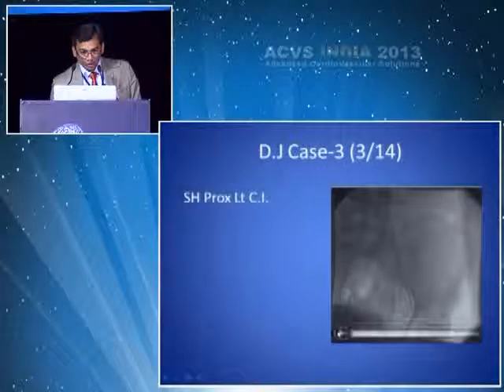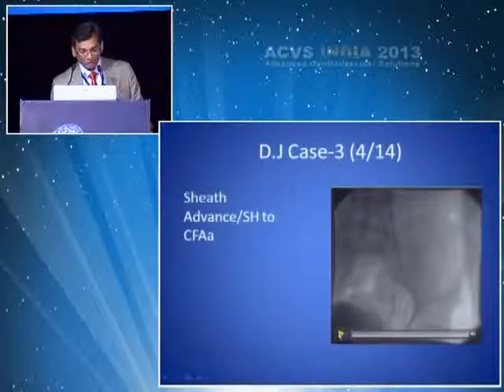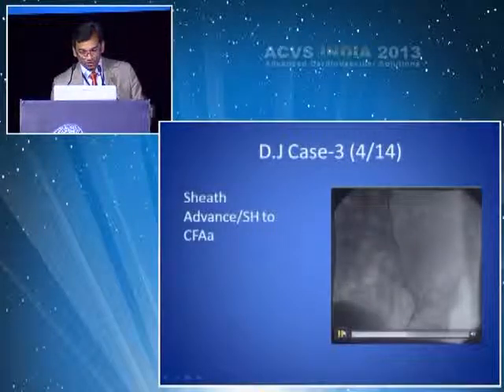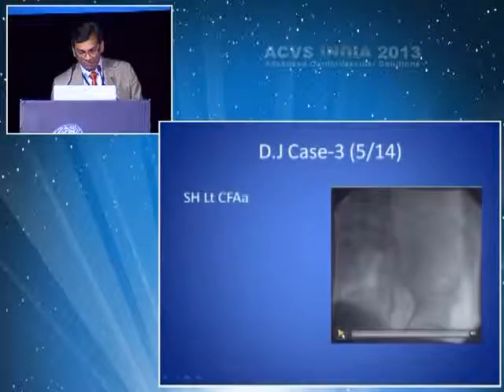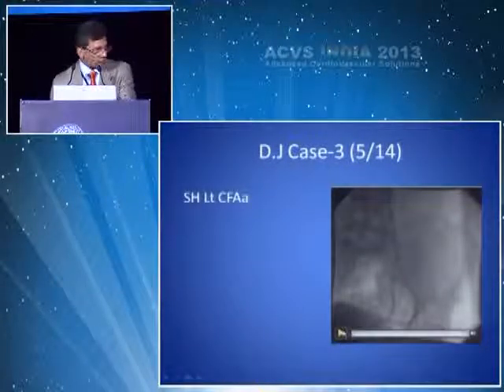So you can do a couple of different things. That's the sheath advance technique that I was talking about, right there. As you can see, the sheath moves with the device. Here's a follow-up angiogram, and there is still 30–40% residual.